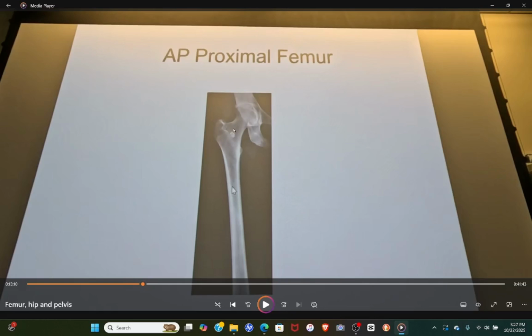And there may be 4 so that what we have is kind of a triangle on top of an inverted triangle. So what we'll have is 1 screw, then we'll have 2 that are parallel to each other, then we'll have 1 screw on the bottom, so that the 1 screw on top and the 1 screw on bottom are kind of in the center between the 2 screws that are parallel to each other. But on the x-ray, being a 2-dimensional image, what you may see is, even though they have 4, 2 of them may be superimposed, and it may only look like there's 3 there.